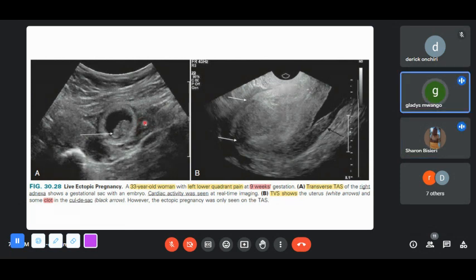But that becomes easier when one is scanning to check if there's any fluid. Usually there is some minimal amount of fluid in the adnexa, some little fluid actually. Right. And then in B? Now in B, we're seeing the hypoechoic fluid collection posterior to the uterus. And we can also see the endometrial cavity is distended with this heterogeneously echogenic mass within it.